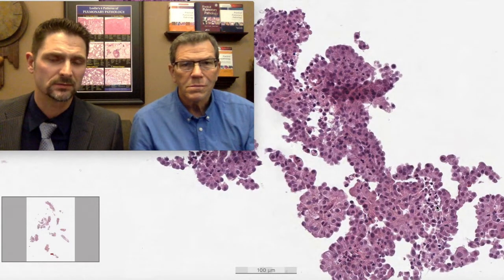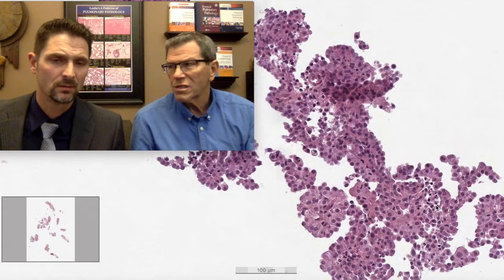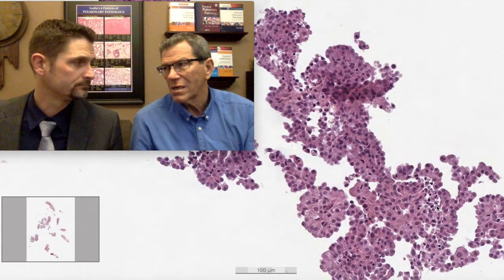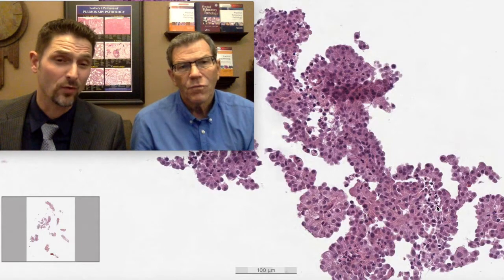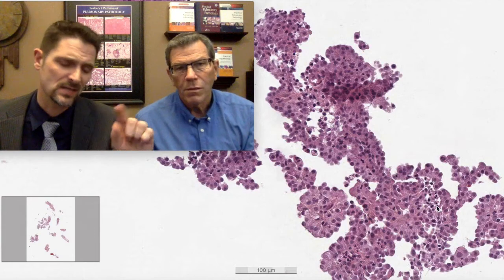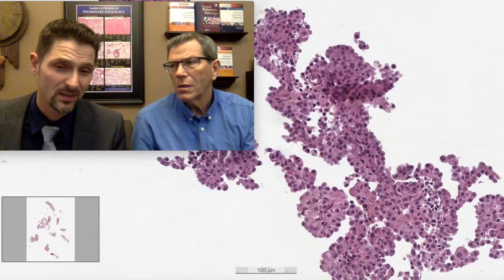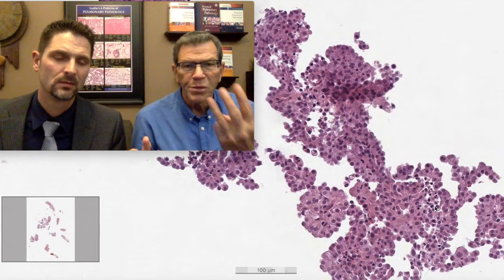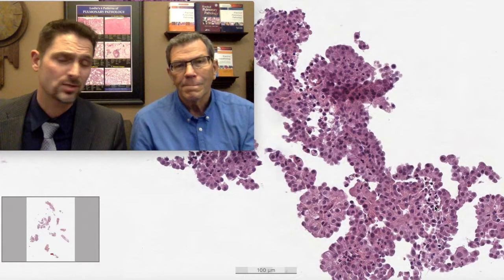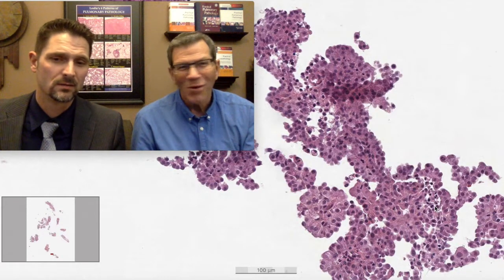In this particular case, this was positive for calretinin, strong. Where was the staining? Nuclear and cytoplasmic. That's important, because that's a specific staining pattern. It was positive for D2-40, membranous. Fried egg, just this nice, strong membranous staining. It was positive for WT1, nuclear. So now we have 3 different staining patterns within 4 antibodies. And cytokeratin 5/6, strongly positive, cytoplasmic. Nice. We've nailed them all.